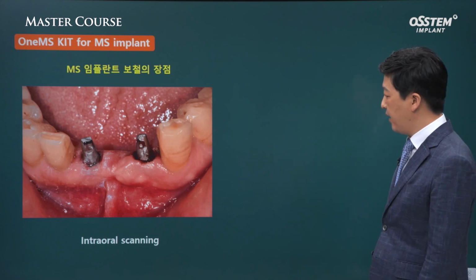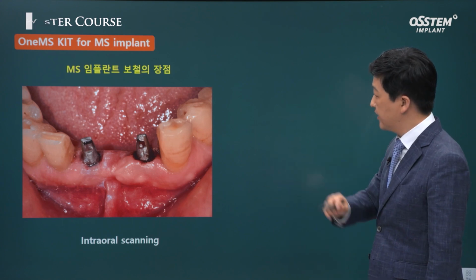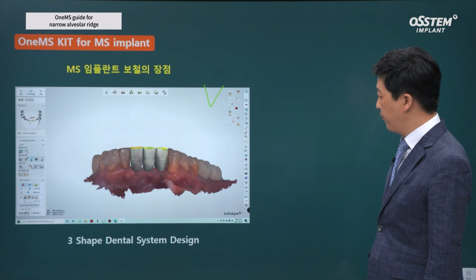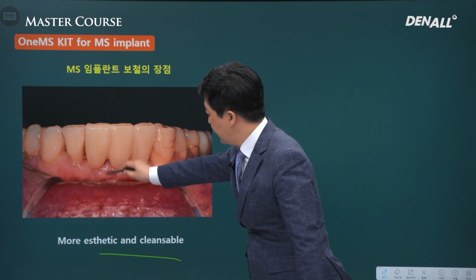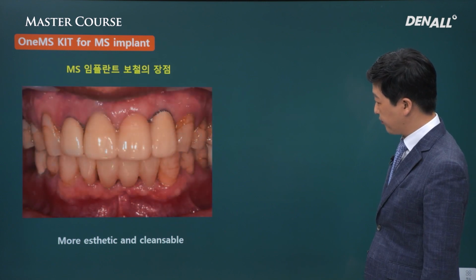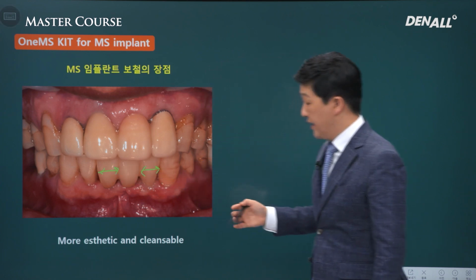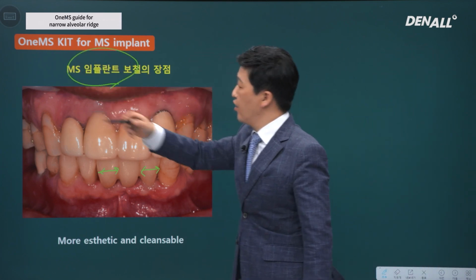After osseointegration, prep was done in the undercut area. Through adjustment, prosthesis was designed using digital dentistry, and this was done in a modular way. In the end, very aesthetic and cleansable prosthesis was provided. As you can see, MS implant can replicate the lower anterior teeth's innate diameter. I think this is almost the only option.